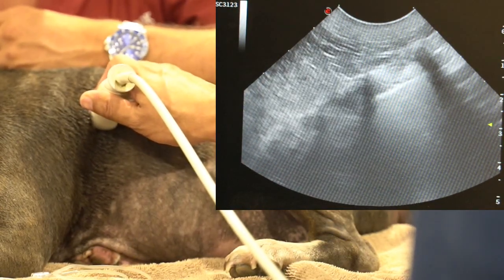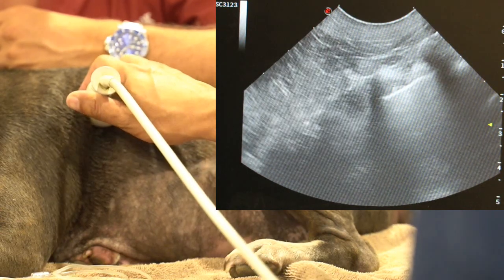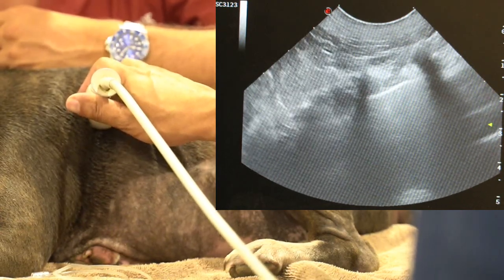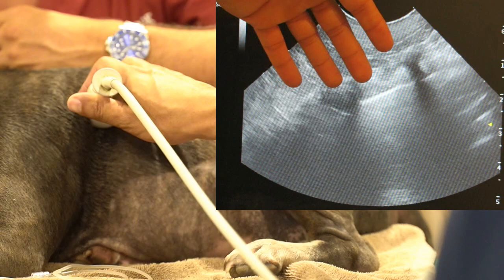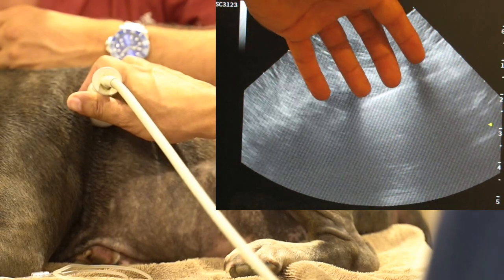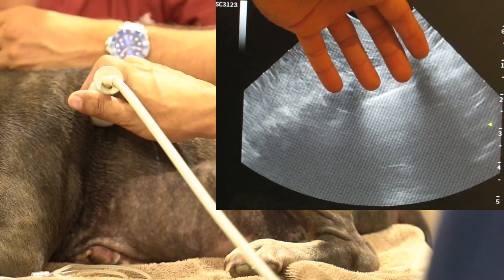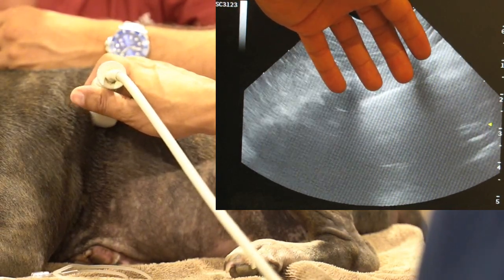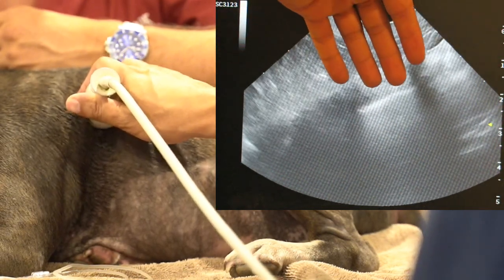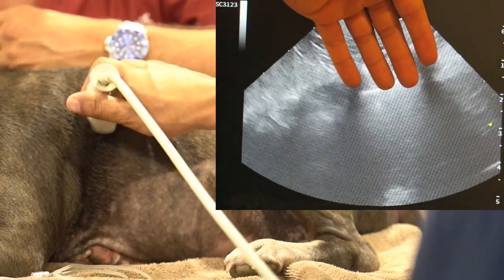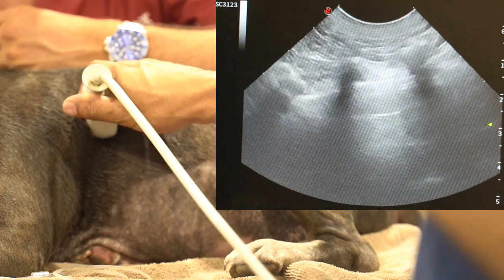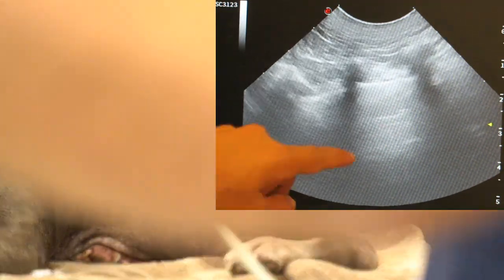After we've found glide sign, we look for A lines or B lines. B lines are vertical bright lines originating from the pleural interface. We don't have any bright lines coming down here, so instead we look for A lines — and we have an A line here, an A line there.